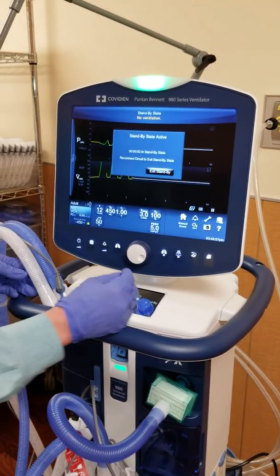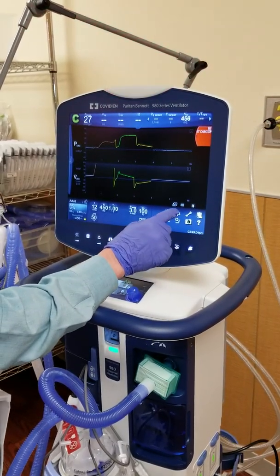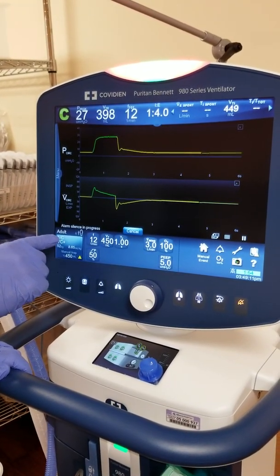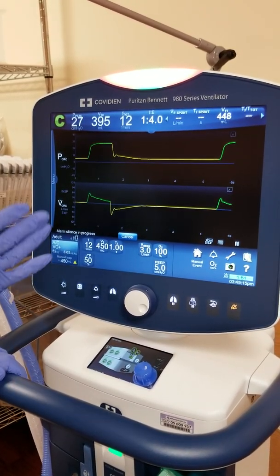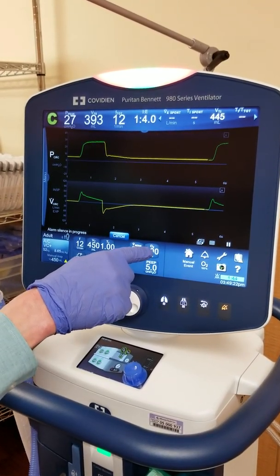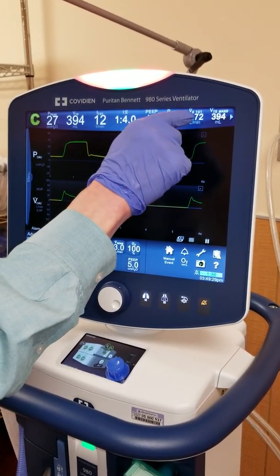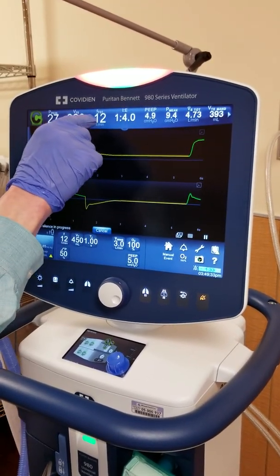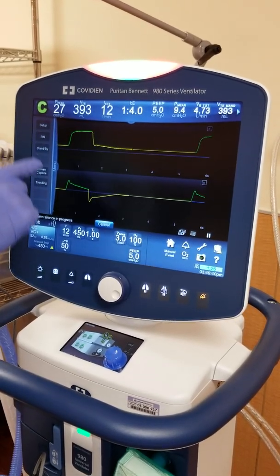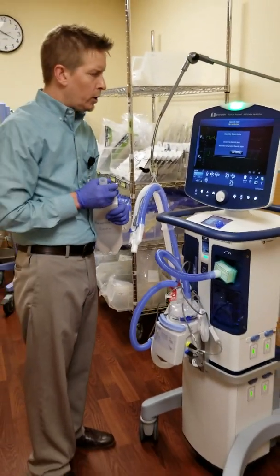So what we're going to do is hit exit standby. I'll just do another quick run through and then I think that should do it. Alarm silence. Mode. This is pretty much always going to be assist control, which is volume plus, which is a PRVC. There's your ordered parameters: rate, tidal volume, FiO2, and PEEP, and here are your measured values. There's your minute volume, your total rate, exhaled tidal volume. And then to put it into standby, I'm going to tap on the menu here, standby, disconnect the patient, and then hit confirm. Okay? I think that'll do it, guys.